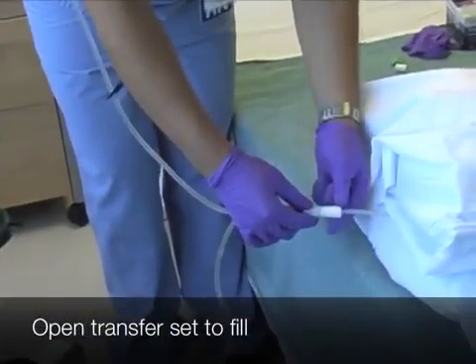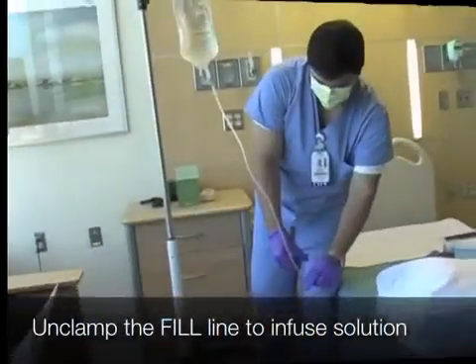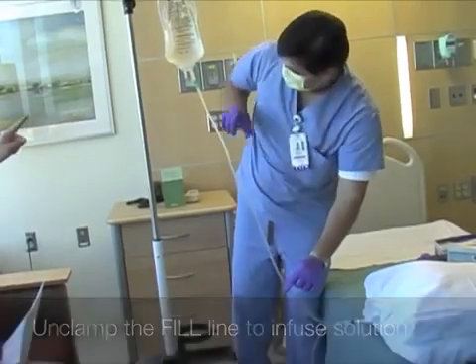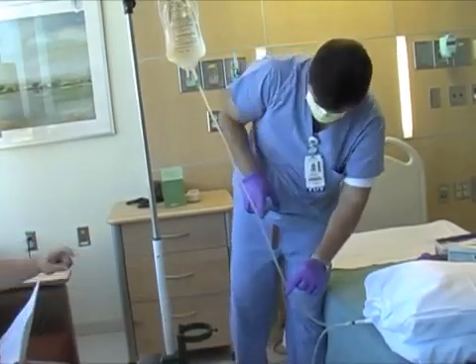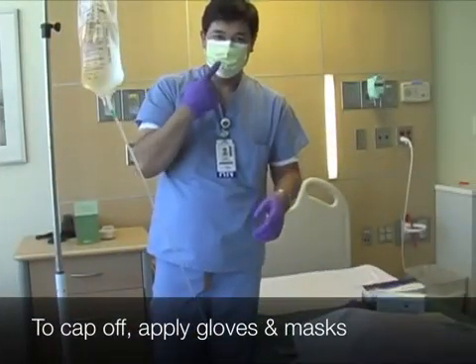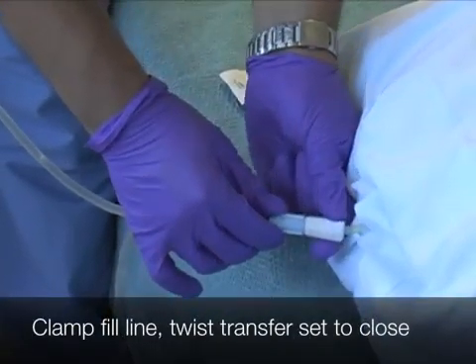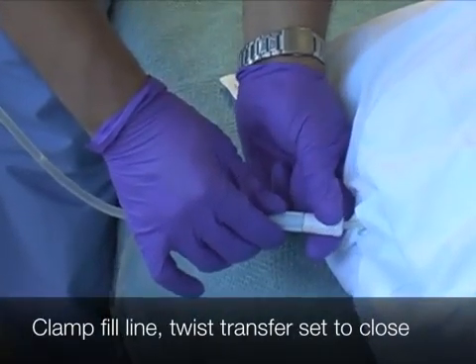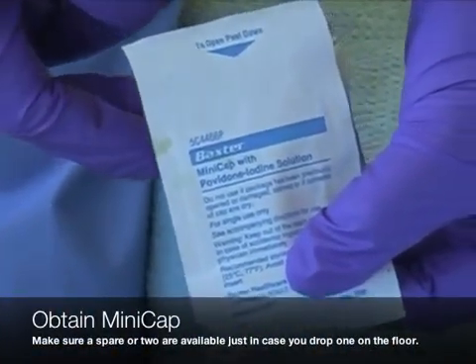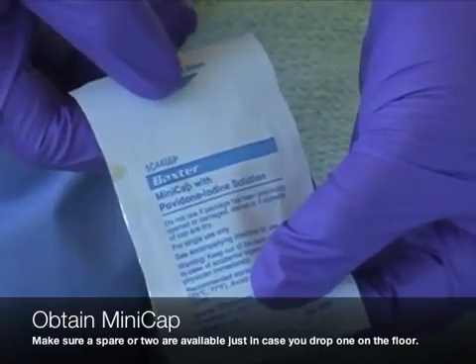Open transfer set to fill and unclamp the fill line to infuse a solution into the patient's abdomen. To cap off, apply gloves and mask. Clamp fill line, then twist transfer set to close. Obtain the mini cap. Make sure a spare or two are available just in case you drop one on the floor.